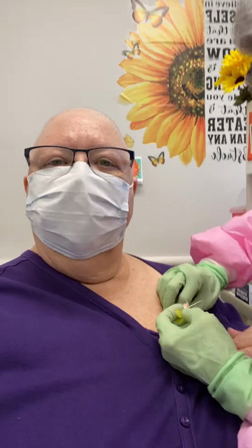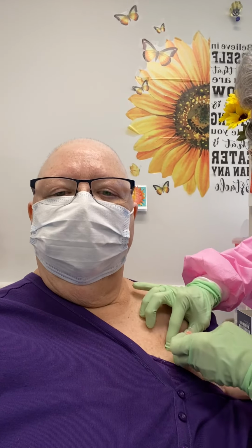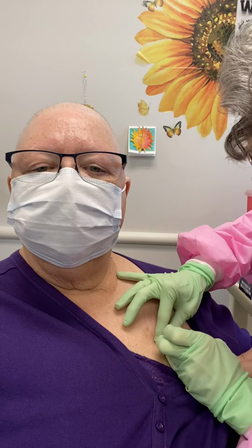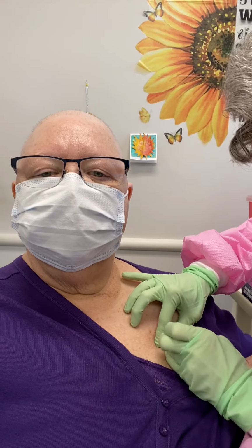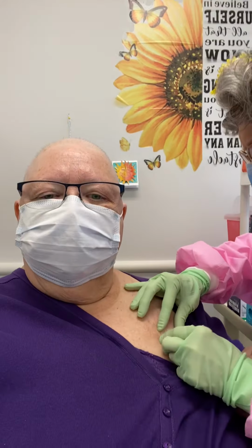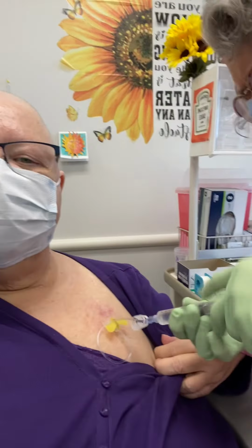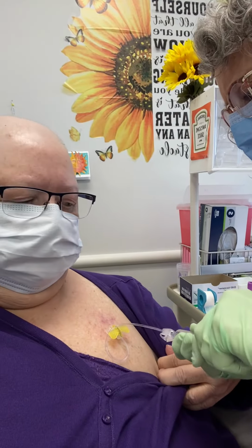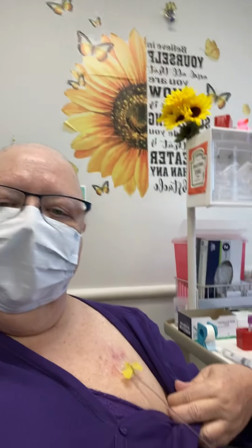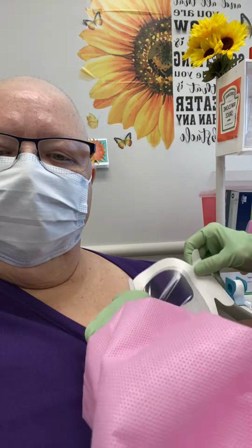Okay, so I have a port in my chest, and she is sticking in a 1-inch needle. Let me wind, and I'll breathe in. And deep breath in. 1, 2, 3. You okay? Yes, it stings just for a minute when it goes in, and otherwise it's fine. So the first thing she's going to do is draw blood, just to make sure I'm in the right spot. And she's in the right spot. And now I'm going to dress you up.